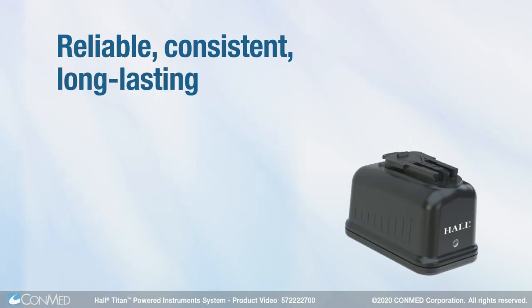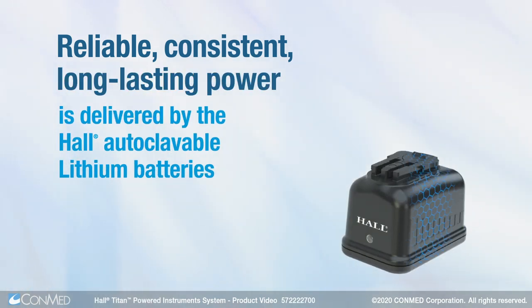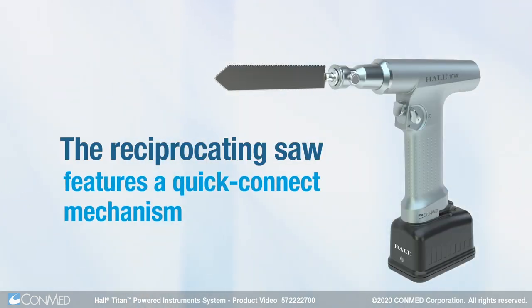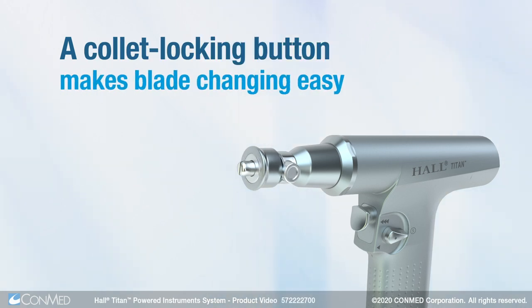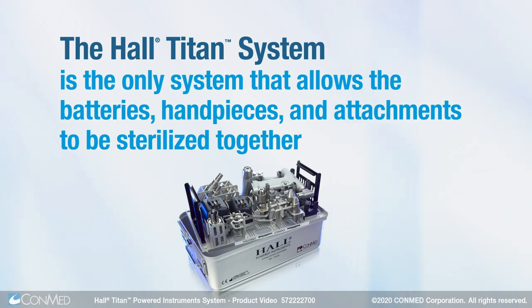Reliable, consistent, long-lasting power is delivered by the Hall autoclavable lithium batteries. The reciprocating saw features a quick connect mechanism. A collet locking button makes blade changing easy.